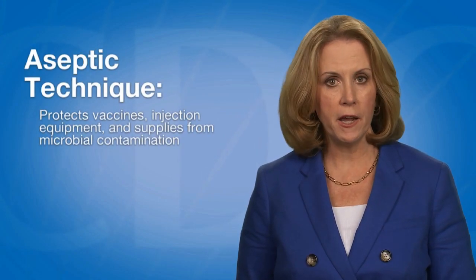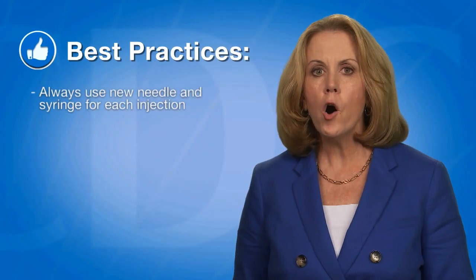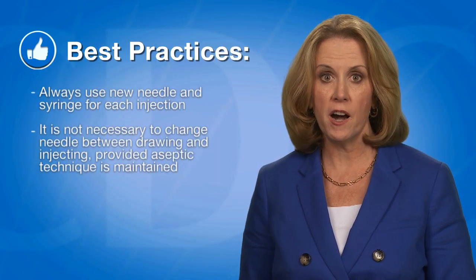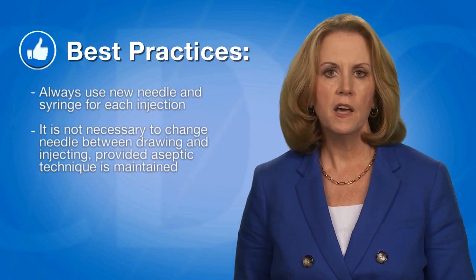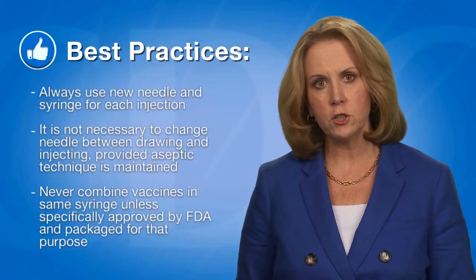When preparing and administering vaccines, always follow safe injection practices and aseptic technique. Aseptic technique refers to the handling, preparing, and storing of medications and injection equipment and supplies to prevent microbial contamination. Always use a new needle and syringe for each injection. It is not necessary to change the needle between preparing and drawing vaccine from a vial and injecting it into the patient unless the needle has been damaged or contaminated. Never combine vaccines in the same syringe unless specifically approved by the Food and Drug Administration or FDA and packaged for that specific purpose.